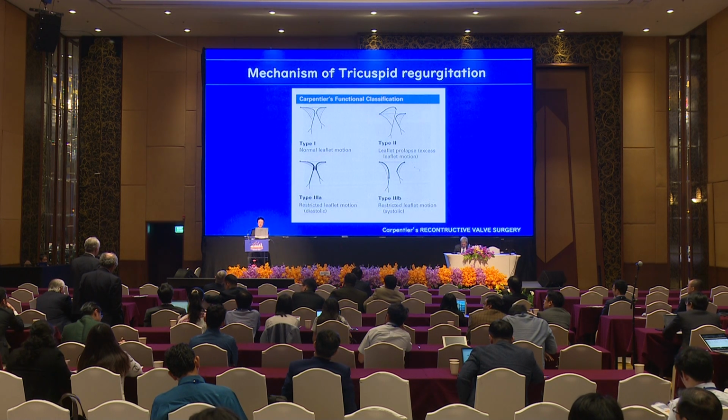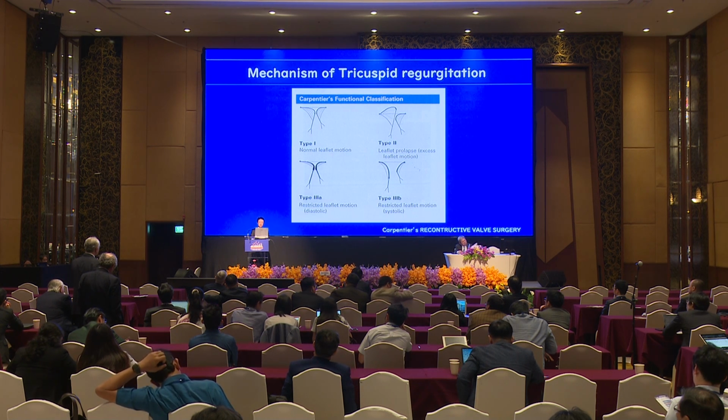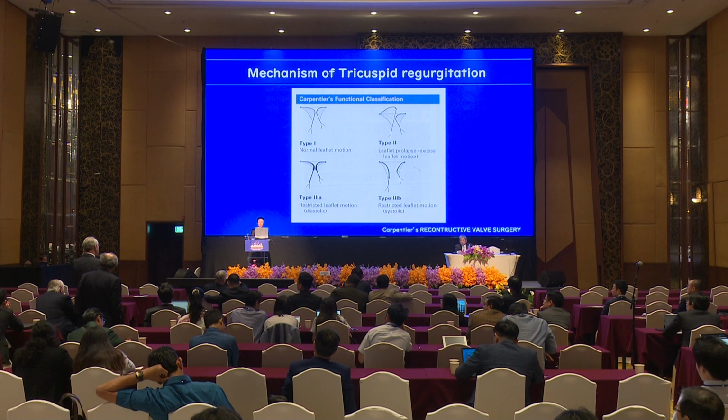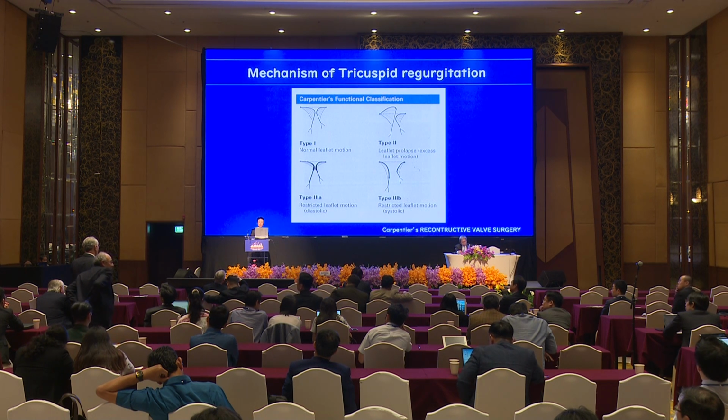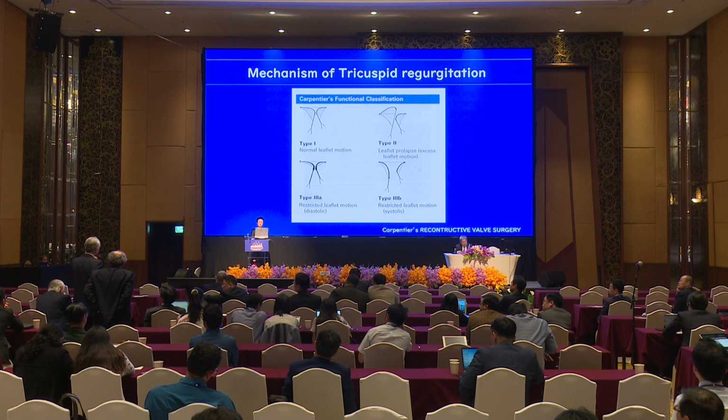So I've never used this material for an endocarditis patient, but I think if the infection is controlled nicely with antibiotics, certainly this is going to be one of the options, particularly in the redo situation with the thickened pericardium. We have seen a couple of recurrent endocarditis with autologous pericardium reconstruction, so it's certainly not absolutely resistant to it.